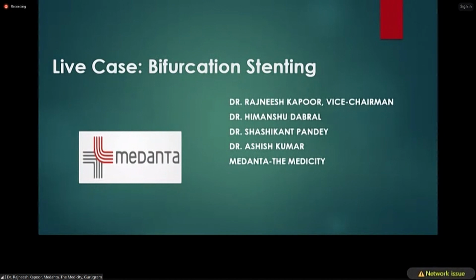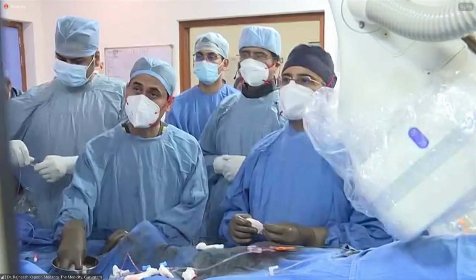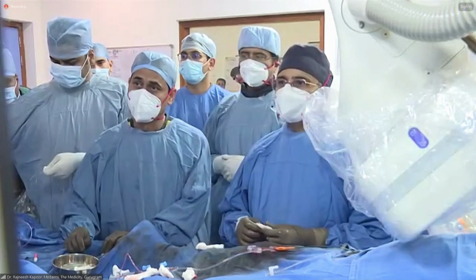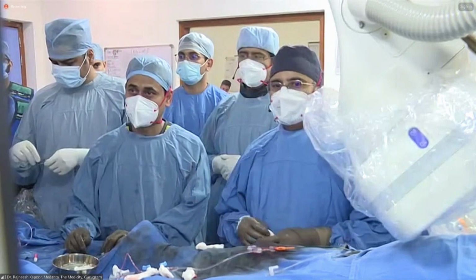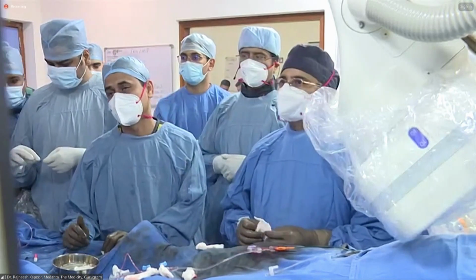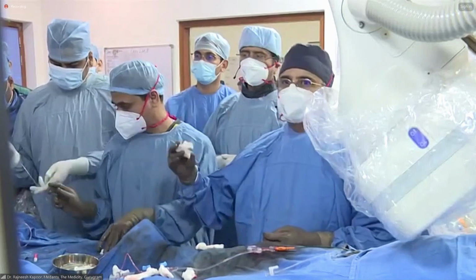Same to you and your team. We are presenting this case from Medanta with me, Dr. Himanshu, Dr. Shashi, Dr. Ashish. We have an elite interventional cardiologist team here, and all the imaging staff, nursing staff, and technicians. We are all set to present this case and we start from the beginning.